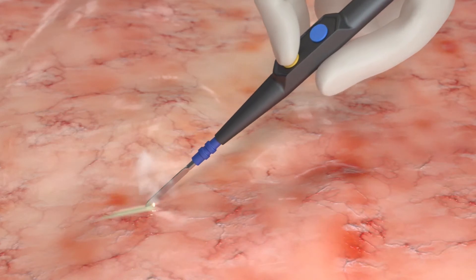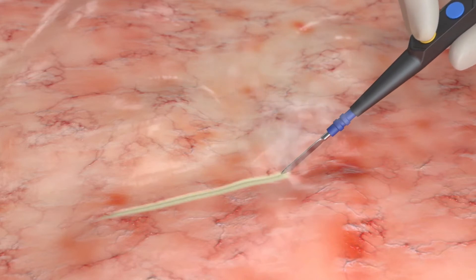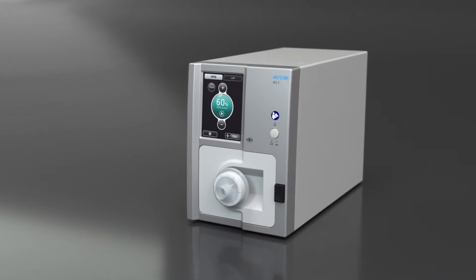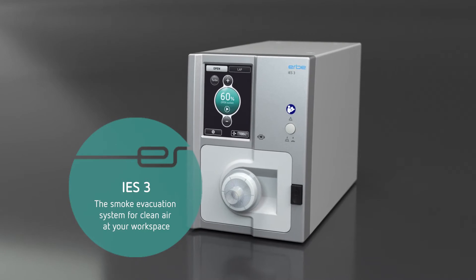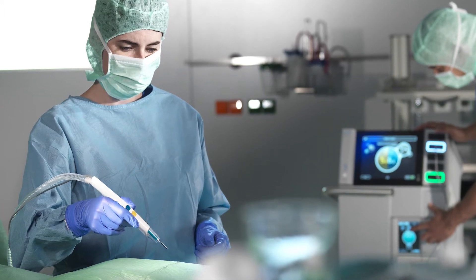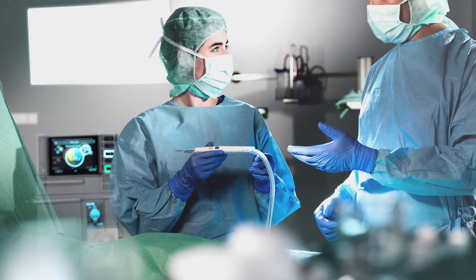Smoke containing potentially hazardous substances is generated during electrosurgical cutting and coagulation of tissue, also in cases of laser and ultrasound applications. The IES-3 smoke evacuation system is our solution for a safe and clean working environment. The IES-3 filters smoke and odors and extracts aerosol-charged air during open surgical and laparoscopic procedures.